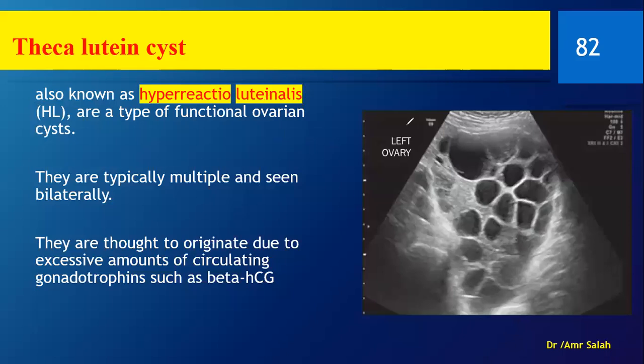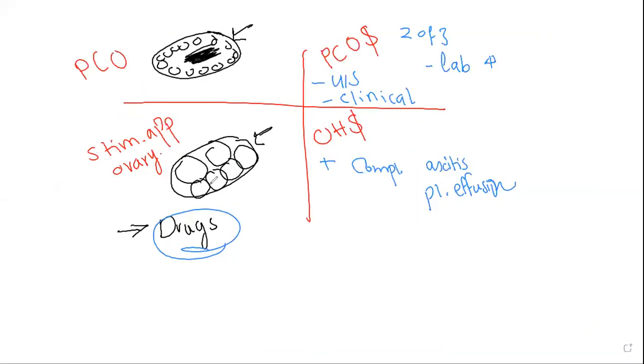Okay, now there's another ovary with many follicles inside. But before attacking this particular case, let's make sure yet another time that we are gathering well all the differential diagnosis of an ovary with multiple follicles. Okay, it's essential that we know how to differentiate these cases.